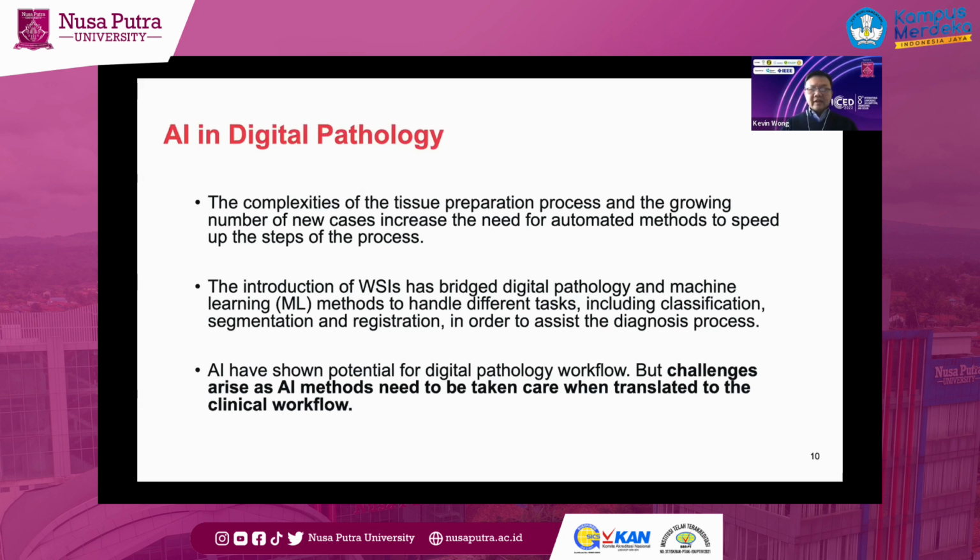But one of the key things we know, if we want to use AI in the digital pathology workflow, is that there are still many challenges we have to take care of before it can be translated to the actual clinical workflow. So you realize that in research, there's always two steps. The first step is to come up with new ideas in the research lab, and more or less try to prove that the concept is working.